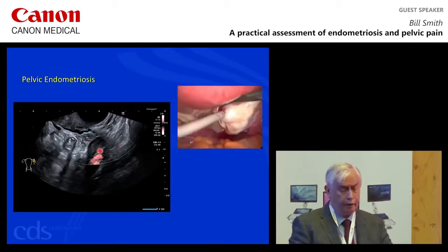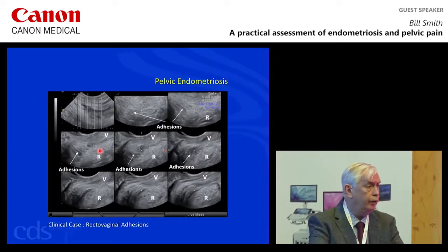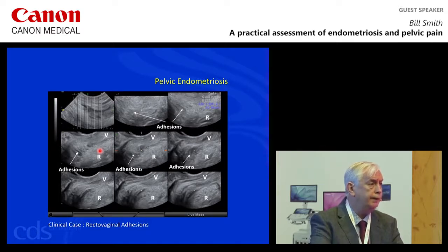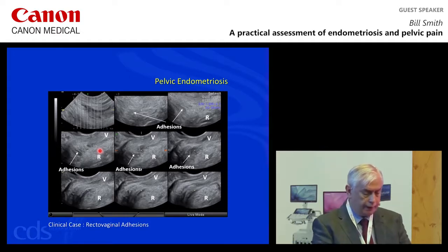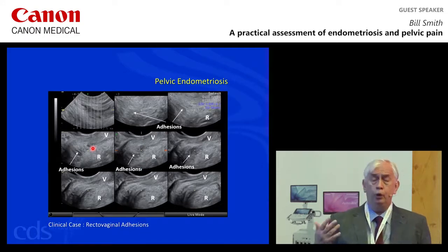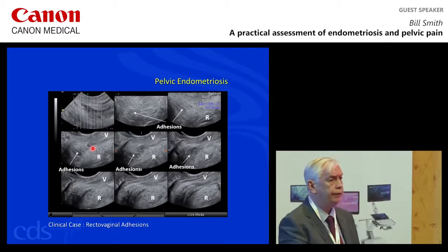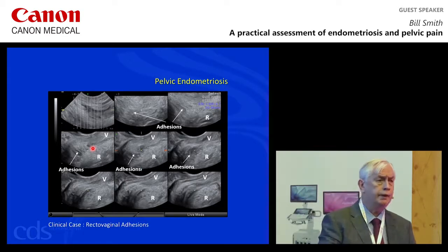that was stuck there. But if we take this case here, there is no way you could have performed a sliding examination on that patient. She would have hit the ceiling. But this case illustrates the value of 3D. What we're looking at here is the rectal-vaginal septum. As we look through our tomographic cuts, as we come to that area there, you can see rectal-vaginal adhesions. And again, this is a 3D diagnosis.